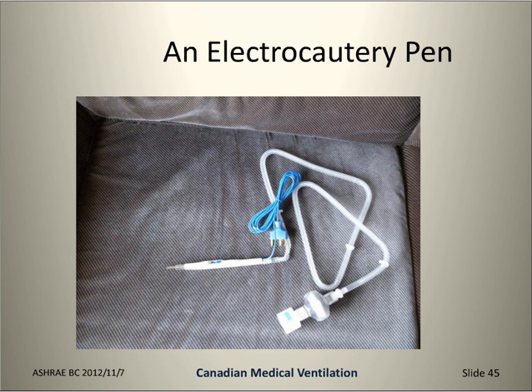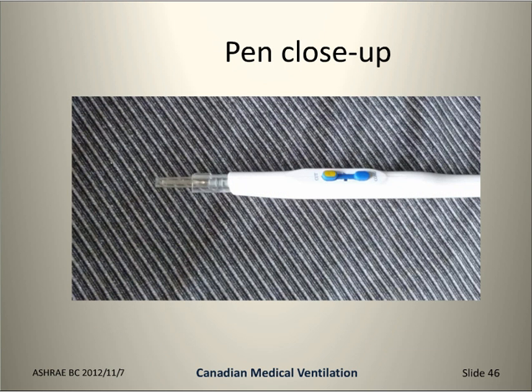What gave anybody the idea that they could have this electrical system to do surgery and stop bleeding? My best guess is that they were dealing with an electrical burn victim, an electric shock victim, and noticed that he'd lost a serious amount of flesh and he hadn't bled much. Maybe this is a good thing, right? Losing the flesh obviously isn't a good idea, but not bleeding when you're cut is maybe not such a bad thing at all.